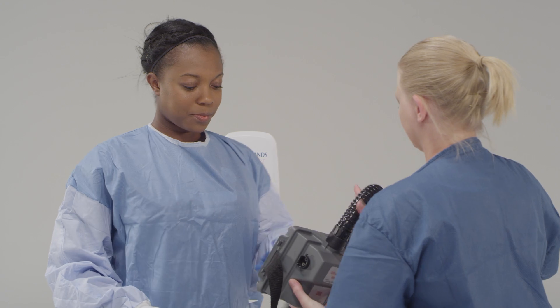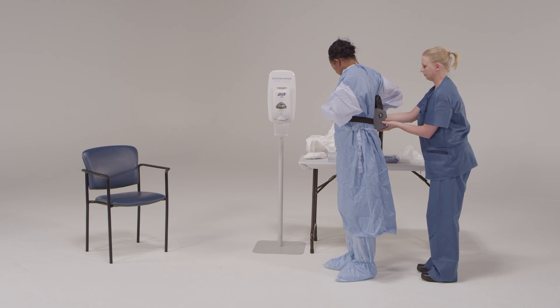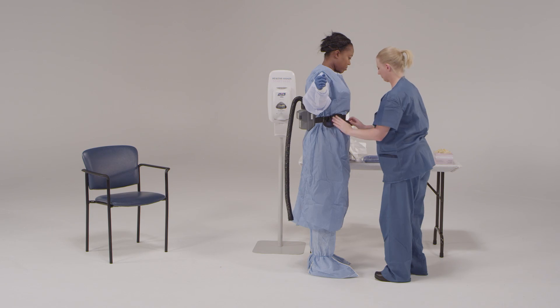The trained observer will hold the respirator at the small of the back while you fasten the belt around your waist snugly and secure any loose straps. The PAPR battery pack and filter unit should be on the outside of the gown to ensure proper air flow.